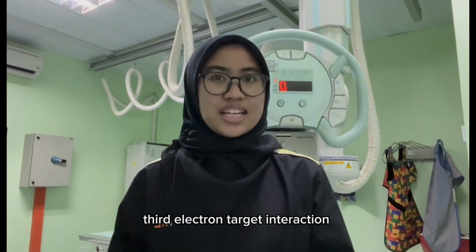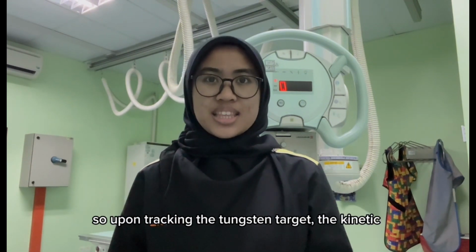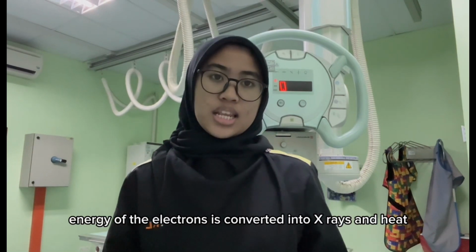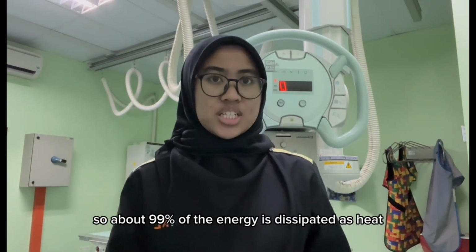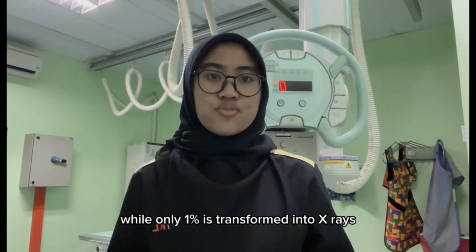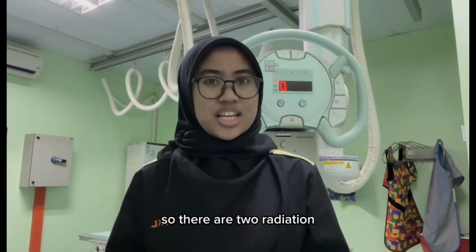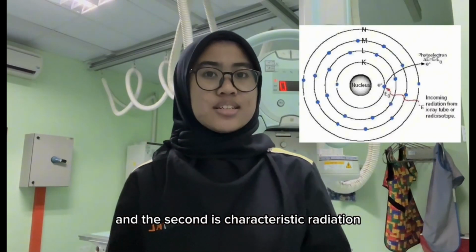Third, electron target interaction. Upon striking the tungsten target, the kinetic energy of the electrons is converted into X-rays and heat. About 99% of the energy is dissipated as heat, while only 1% is transformed into X-rays. So there are two types of radiation: first is Bremsstrahlung radiation and the second is characteristic radiation.